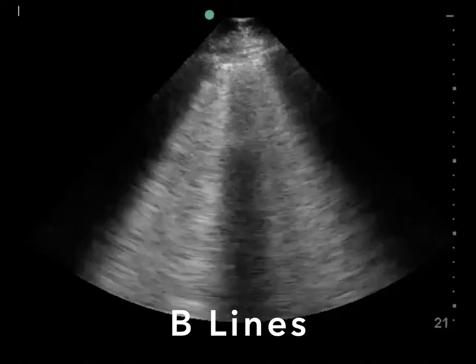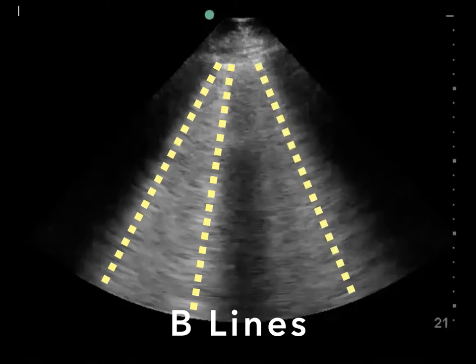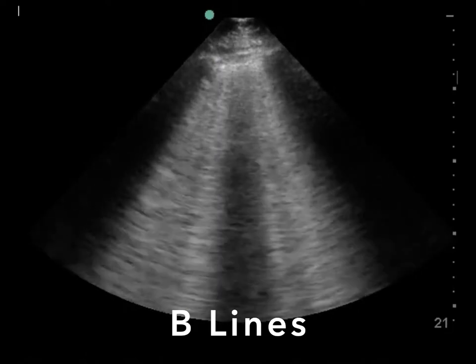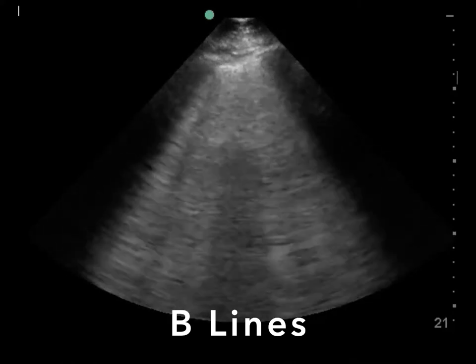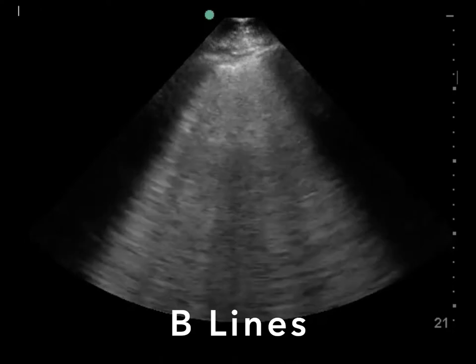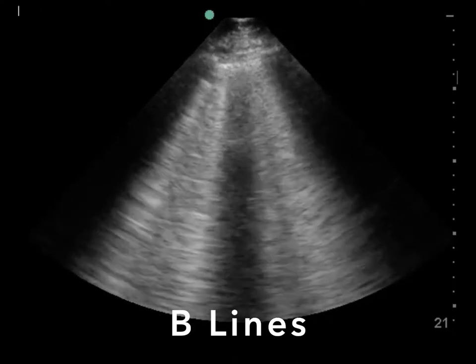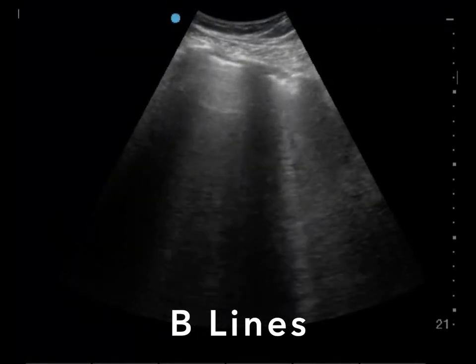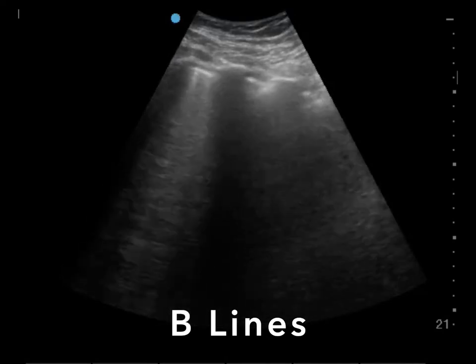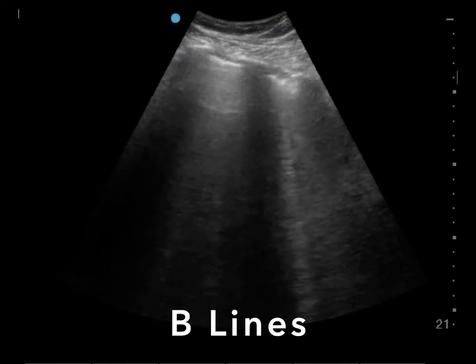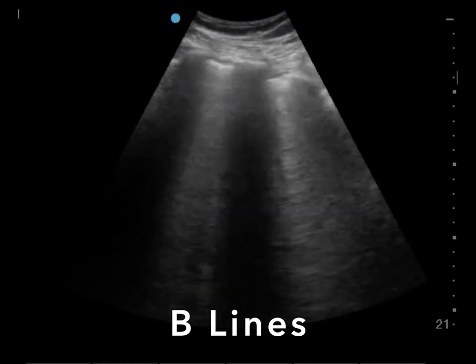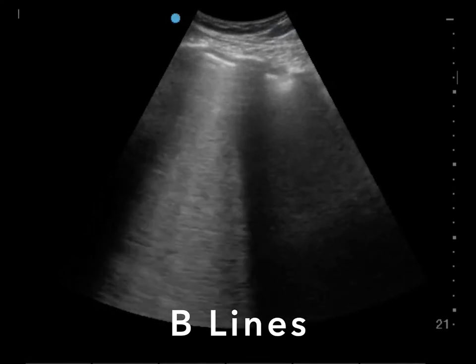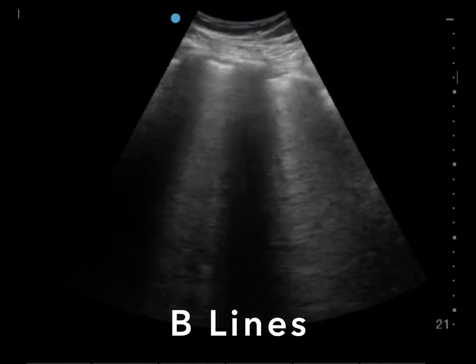B lines are bright white vertical laser-like lines that start at the pleura and extend vertically all the way down the screen to at least 14 to 16 centimeters deep. They move with the movement of the pleural line and they obliterate A lines. B lines are an artifact that represent the thickening of the interlobular septa and are a sonographic representation of alveolar-interstitial syndrome. The most common cause of B lines is pulmonary edema, but they can also be caused by infection, pneumonitis, pulmonary hemorrhage, pulmonary fibrosis, interstitial lung disease, and ARDS. Patients are allowed to have an occasional isolated B line in one or two lung zones, but having multiple B lines in a single interspace is abnormal.